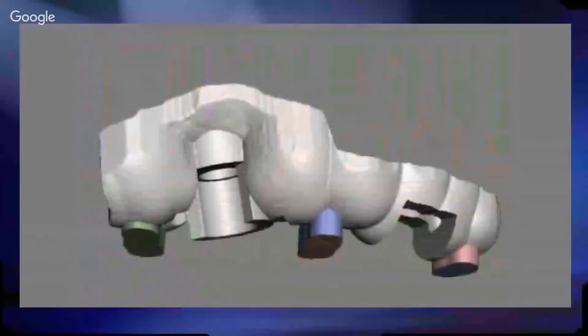Now, what's going to happen with SLA type printers like the Formlabs and the Moonray and the Xiav is the first layers are going to be over cured so that they stick nicely to the build platform and don't fall off during the printing process. This presents a problem though, because for example, in the Form 2, there's a 3mm layer that's printed over cured, and in that area you'll get distortion. That's why you want to move the print from the platform.